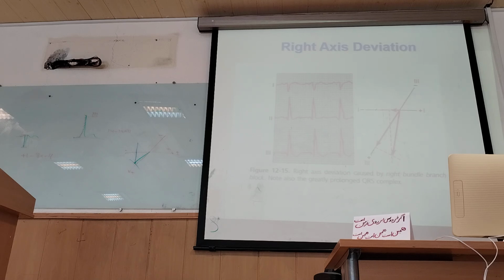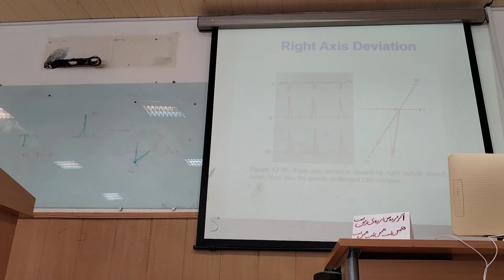How many abnormal cases do we have for the heart? For example, right axis deviation, left axis deviation. This is electrocardiographic abnormality; we also have mechanical abnormality. Right now, the electrical, graphical one. We will discuss it. The first thing you have already discussed is right axis deviation. What is the reason for right axis deviation? Pulmonary stenosis. First, pulmonary hypertension.